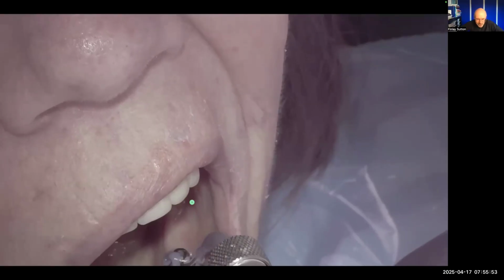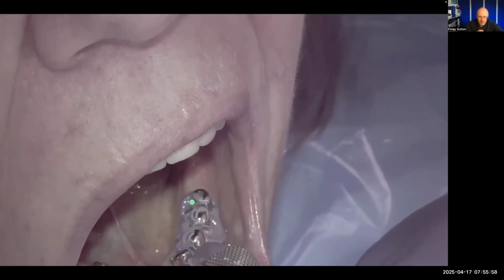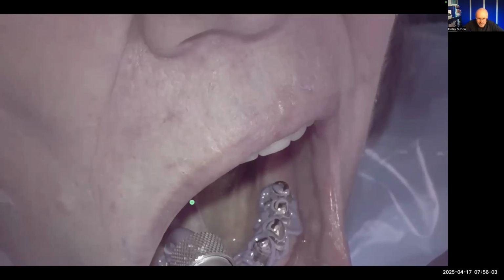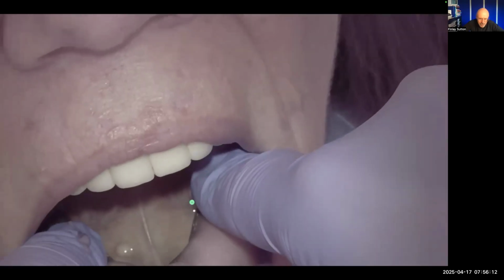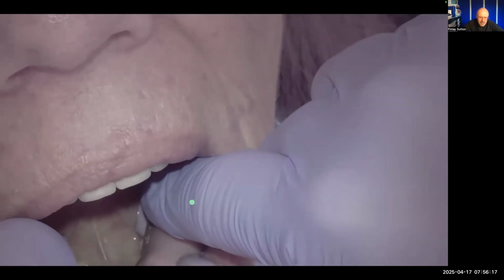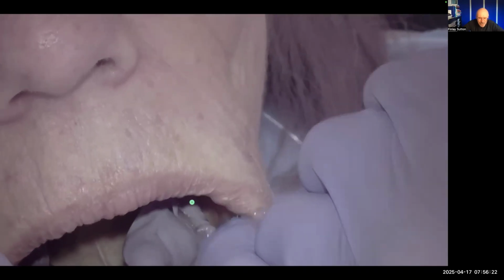Now, I have to apologise, I'm really sorry, but my camera was not really showing you what I was looking at here. It's attached to my loupes, but you can see I'm squirting around those gold abutments some of the Impregum. I then pick up the tray, rotate it over. This has got the Impregum loading it in. I push firmly down so that the Impregum and the impression tray seats onto my compound stops.